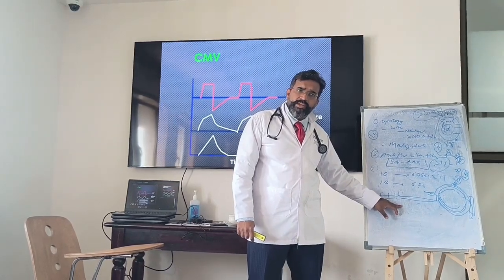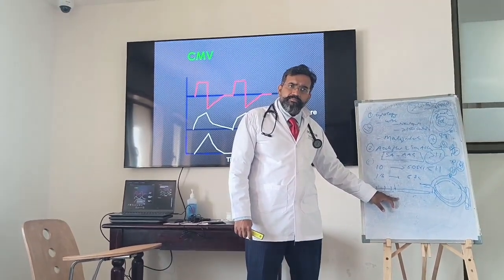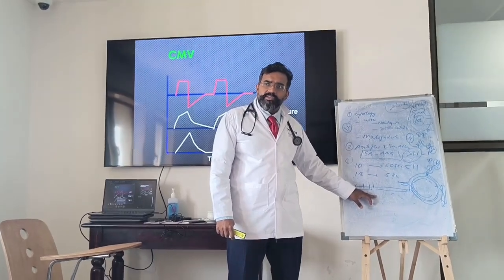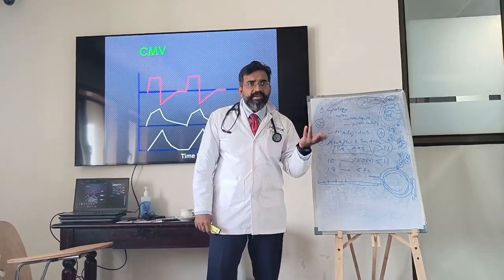मैंने क्या बोला है? Inspiration is 2 seconds, expiration is 4 seconds. That means I am controlling it by time. मैंने उनको क्या बोला है कि cycle it with respect to time. मतलब 2 seconds inspiration होने के बाद go to expiration. You understand? So it is time cycle.